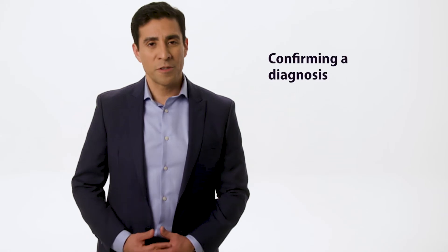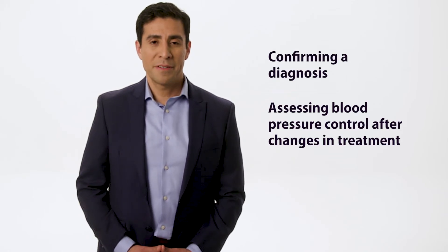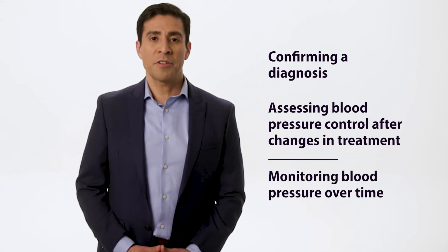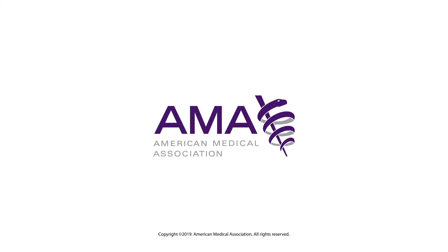Self-measured blood pressure monitoring is a great way for your healthcare provider to get a more complete picture of your blood pressure — for confirming a diagnosis, assessing blood pressure control after changes in treatment, and monitoring blood pressure control over long periods of time. Remember, you play an important role in ensuring the results your physician or health care team receives are accurate. With accurate information, your care team can come up with the best treatment plan for you to improve control of your blood pressure.